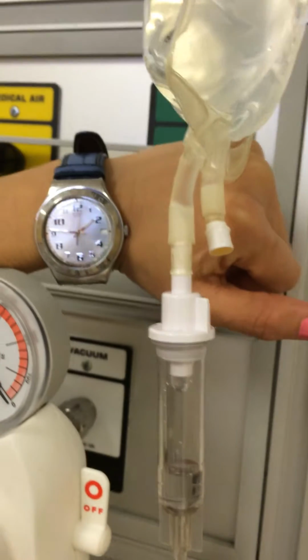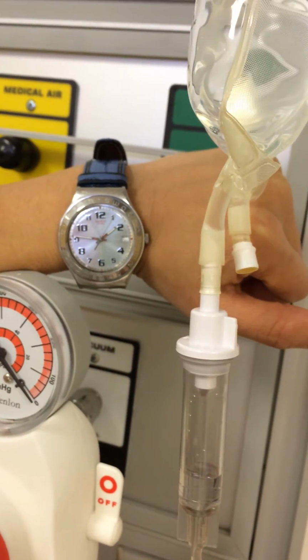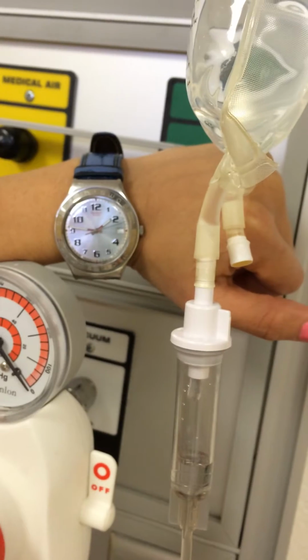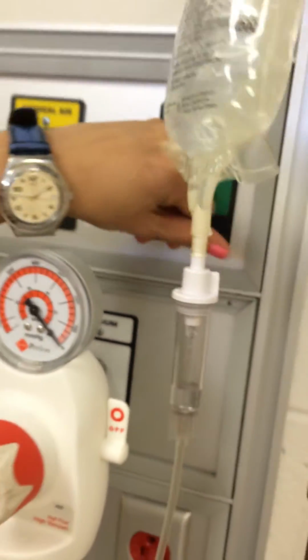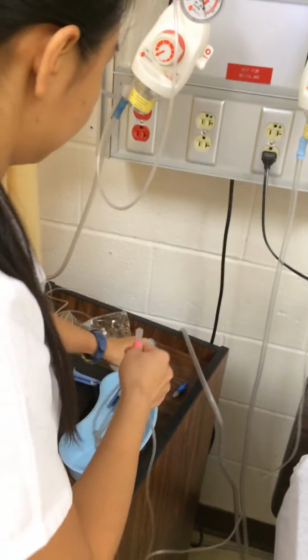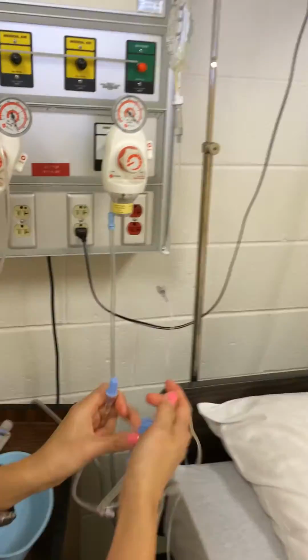Okay, I start to count: 2, 3, 4, 5, 6, 7, 8, 9, 10, 11, 12, 13, 14, 15. I clamp it, and I close the tubing before I give it to the patient.